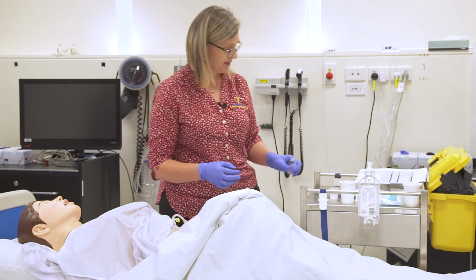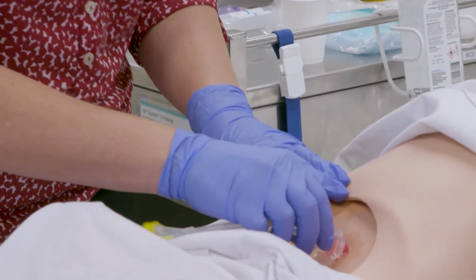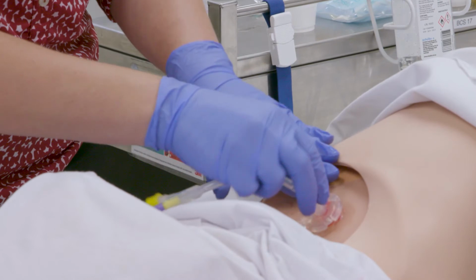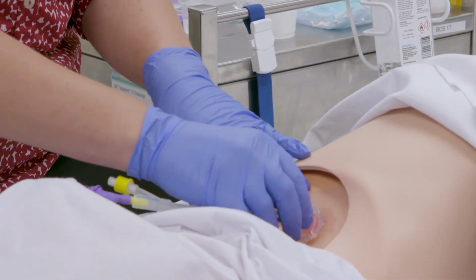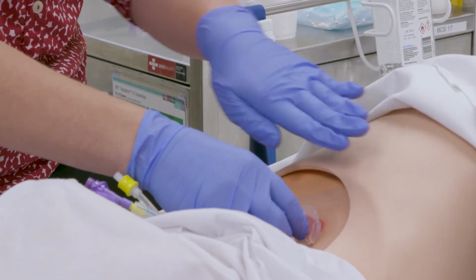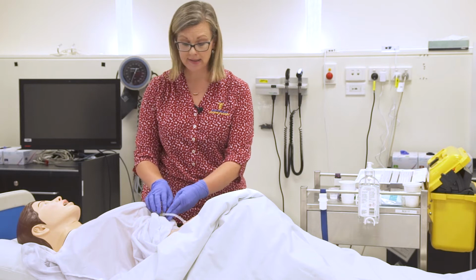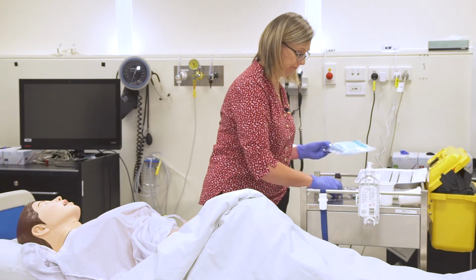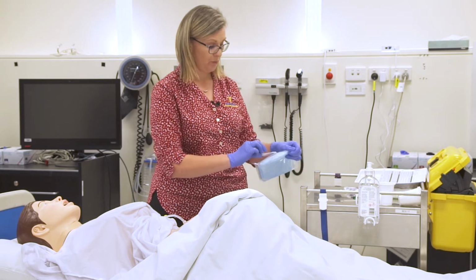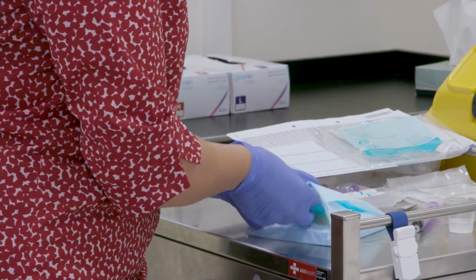Mary, in the shower today, are you able to give your area a wash? So for cleansing of the PEG tube in the shower, Mary can run some clean warm water over it, use a flannel either side. If Mary was unable to get into the shower and needed assistance, you would use a sterile pack and some normal saline. So opening the pack, attending to your aseptic technique.